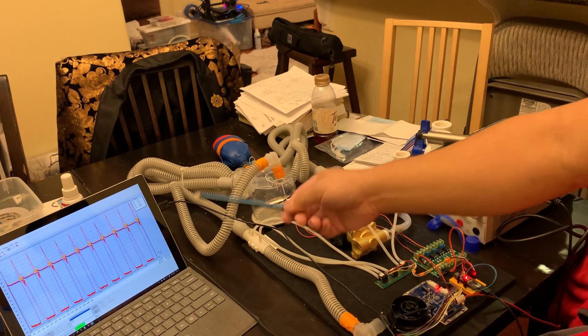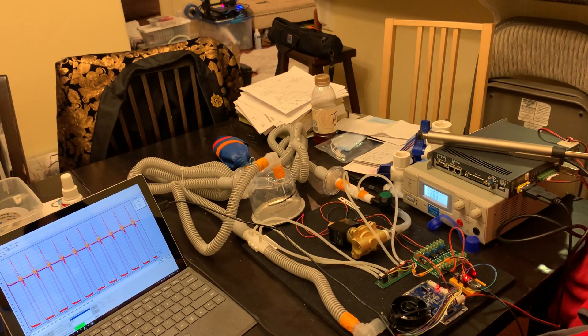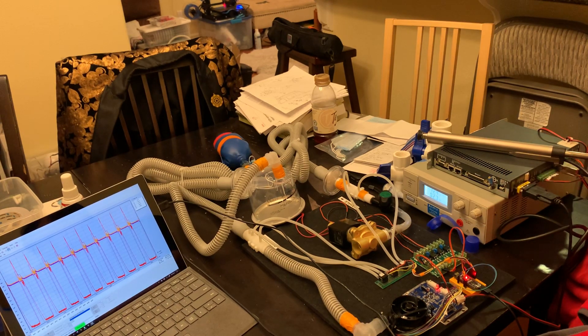We're collecting all the data here and we'll be sending that off to our software team that has been working hard around the world to develop the algorithms to run the ventilator. Thanks for joining me. That's it for now.